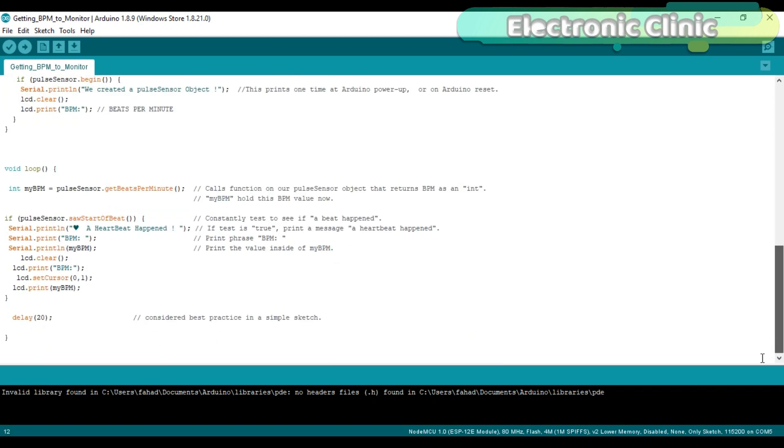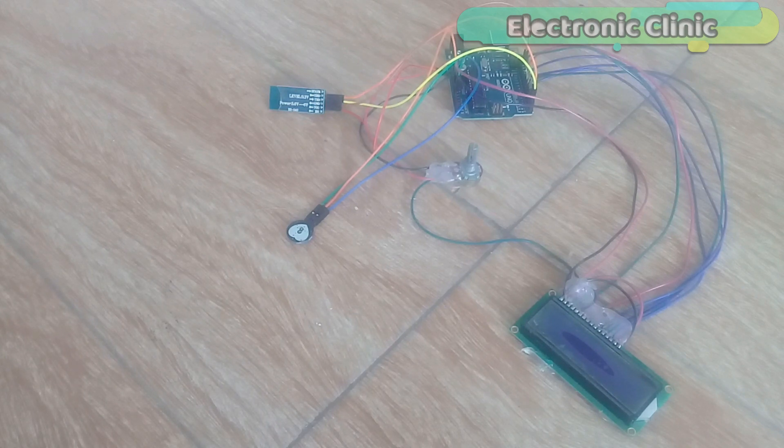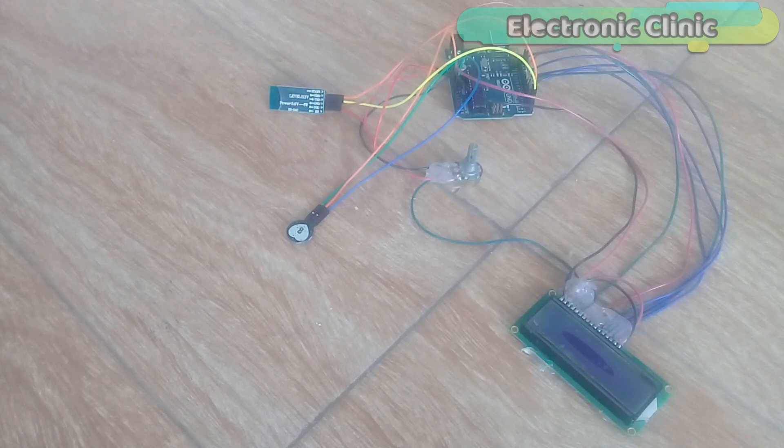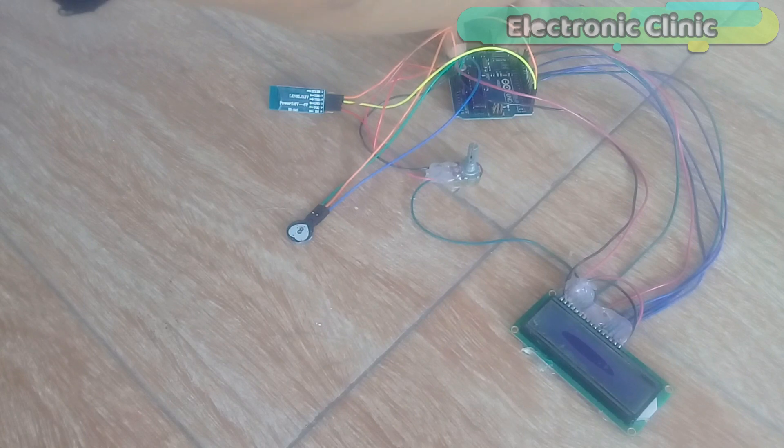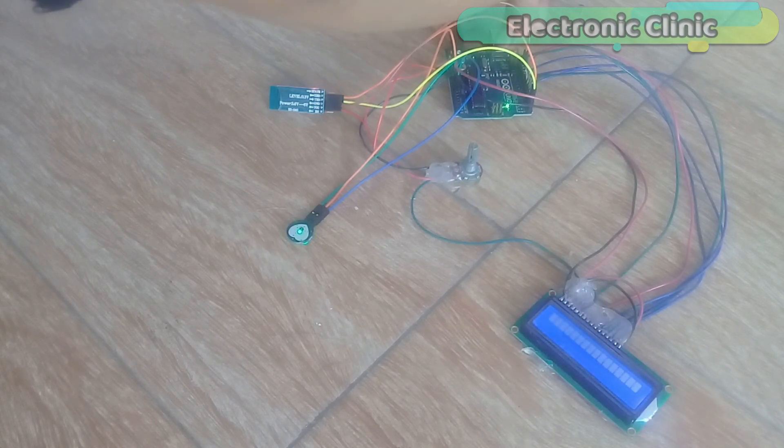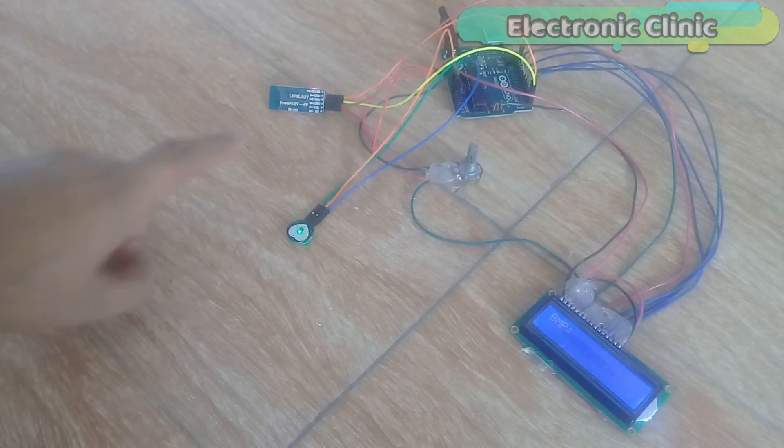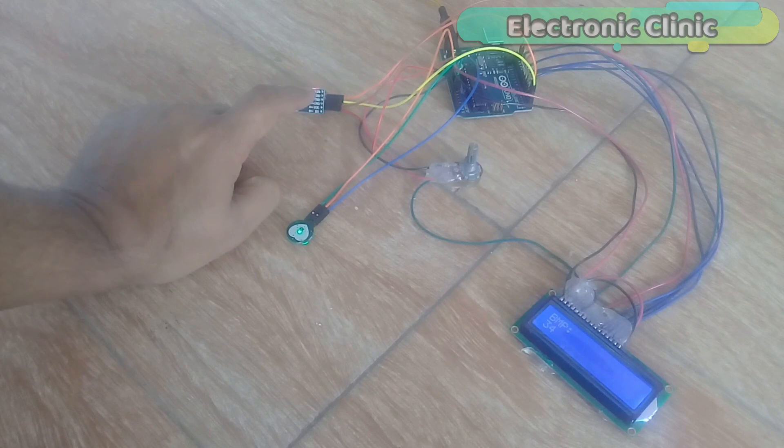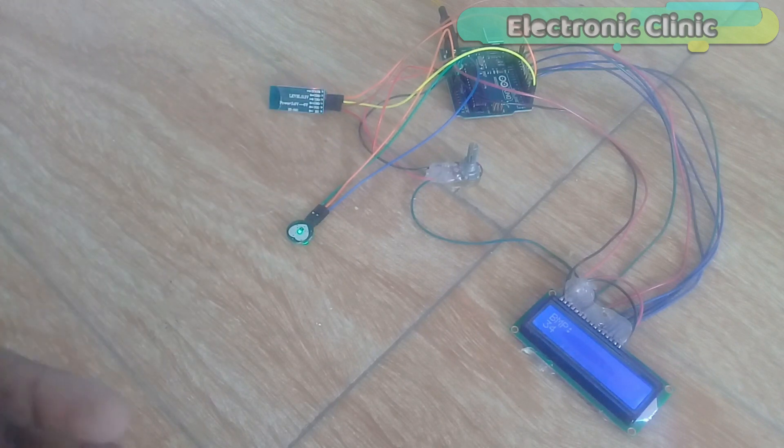Let's watch this project in action. All the components are interfaced as per the circuit diagram. The Bluetooth module TX and RX pins are connected with pin 0 and pin 1 of the Arduino, while the 5V and ground pins are connected with the Arduino's 5V and ground.